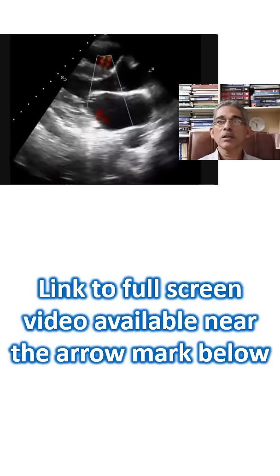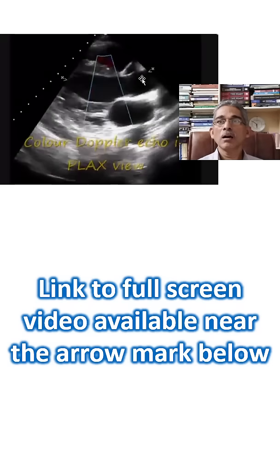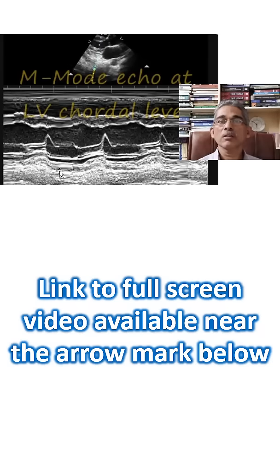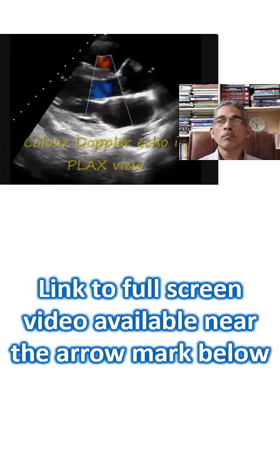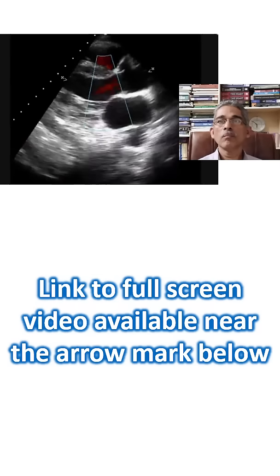If you look at it, you can see ejection into the aorta was seen as red because it is towards the transducer.